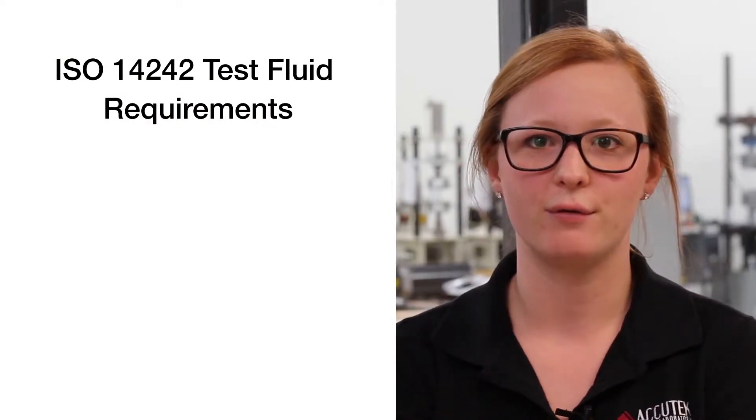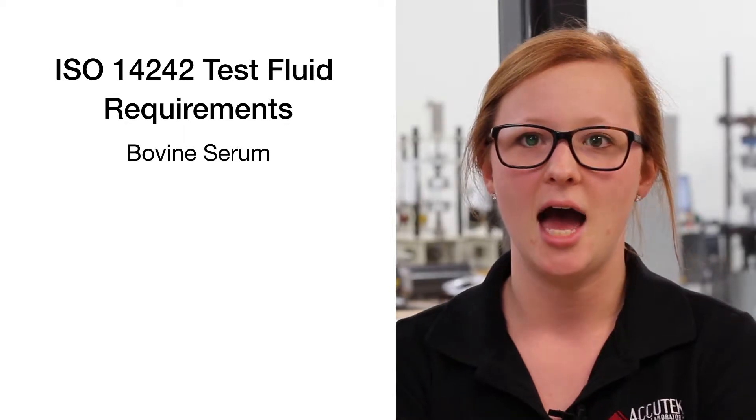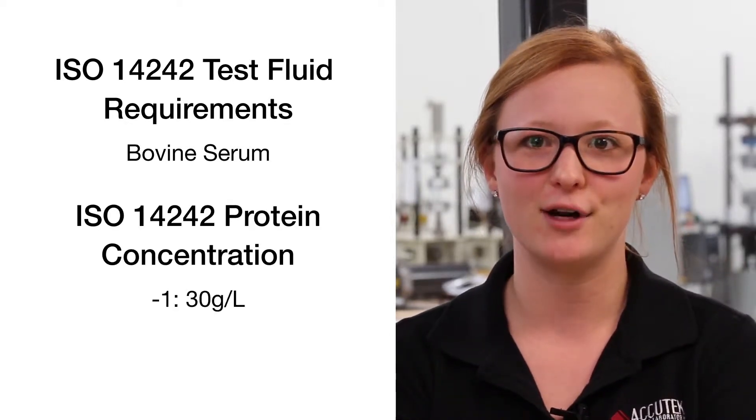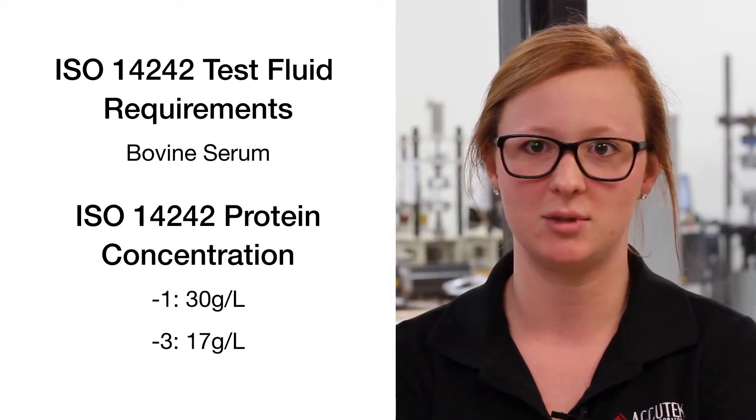To summarize, both ISO 14242 specs call for the use of bovine serum. However, dash one requires a protein concentration of 30 grams per liter, while dash three calls for a concentration no less than 17 grams per liter.